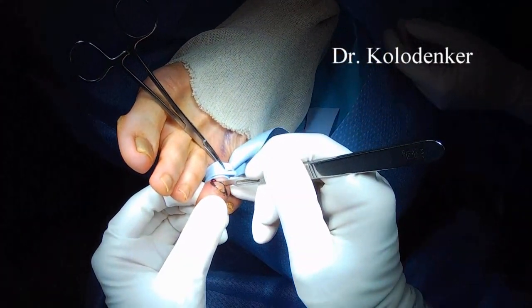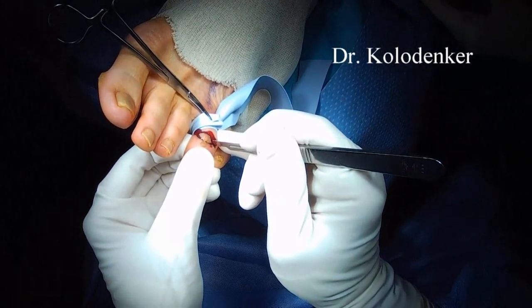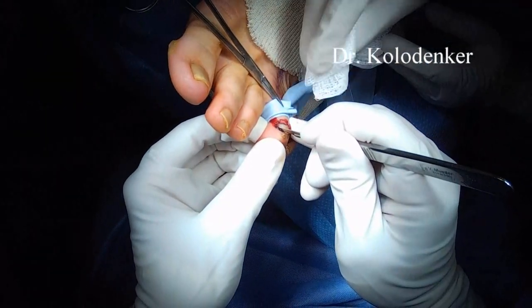Typically we'll make two semi-elliptical incisions. Hemostasis — blood control — requires some sort of tourniquet. In this case I'm using a toe tourniquet, but you can use an ankle tourniquet.